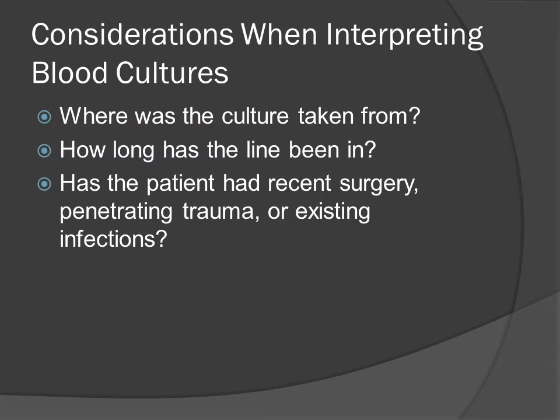A single blood culture also lacks sensitivity and really precludes the ability to distinguish contaminants from true bacteremia with bacteria that are common contaminants. Really common contaminants are coagulase-negative staphylococci and diphtheroids. Most clinically significant bacteremias are detected within 48 hours with the use of instrument-based continuous monitoring blood culture systems. Detection of fungemia may require 24 to 48 hours of additional incubation. Both common and fastidious pathogens may be detected within 5 days of incubation with modern automated blood culture detection systems. An extended incubation beyond this time frame is generally not necessary.